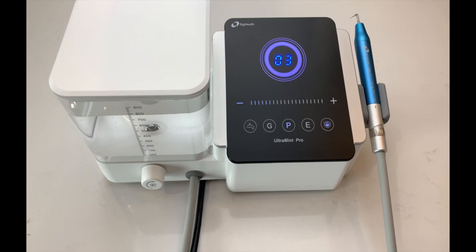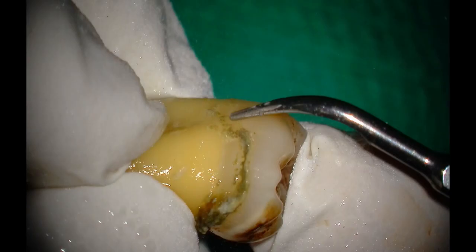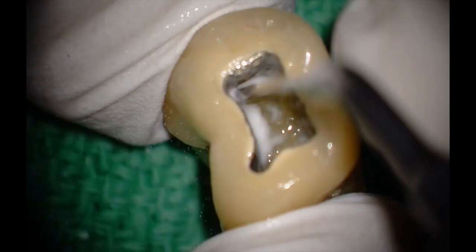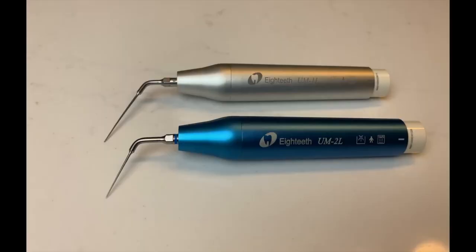Introducing the revolutionary Ultramint and Ultramint Pro ultrasonic scalers — one scaler, two solutions. The Ultramint Pro is an incredible piece of technology that is sophisticated and simple at the same time. Whether your supragingival scaling, tenacious calculus removal, or a plethora of endodontic procedures, the Ultramint ultrasonic system has you covered.